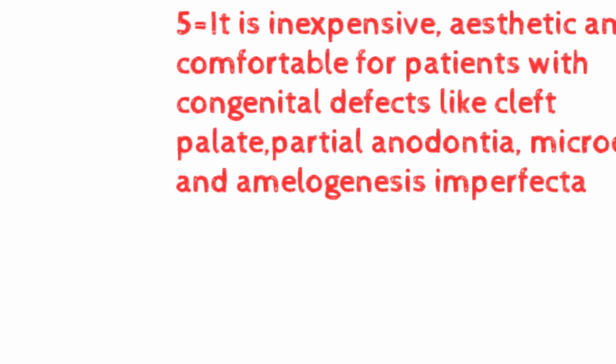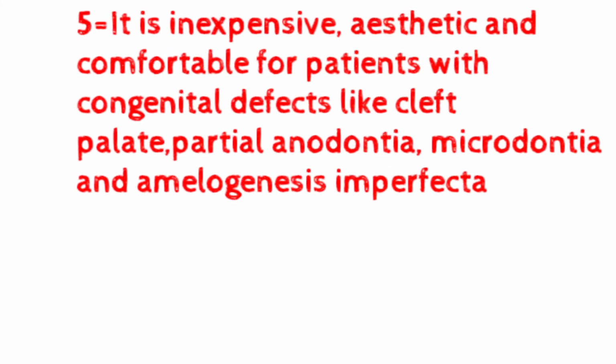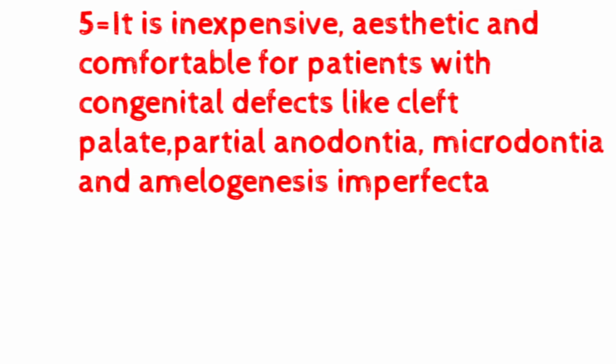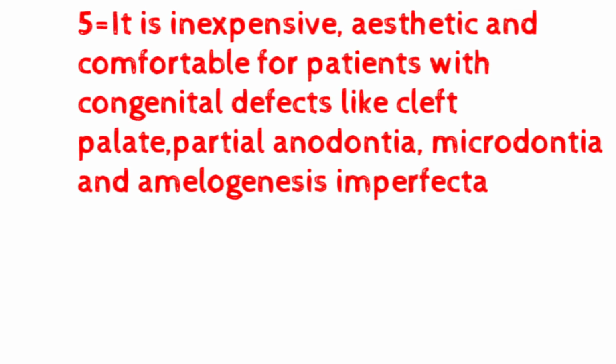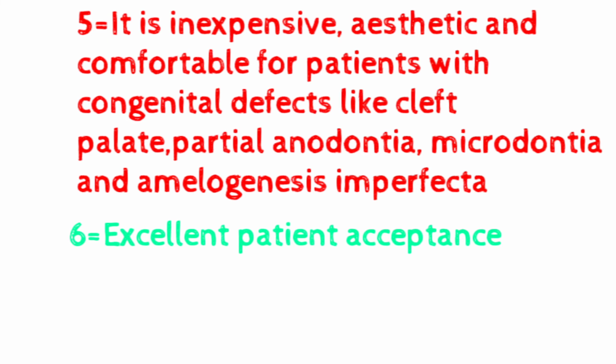Next advantage, it is inexpensive, aesthetic and comfortable for patients with congenital defects like cleft palate, partial anodontia, microdontia and amelogenesis imperfecta. Next advantage is excellent patient acceptance due to its aesthetics and retention.